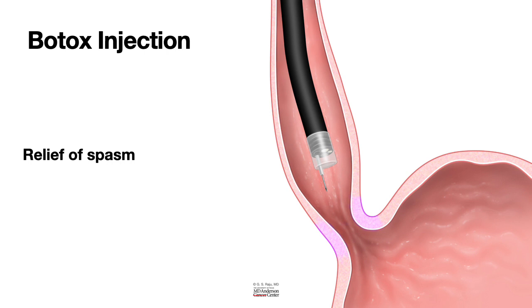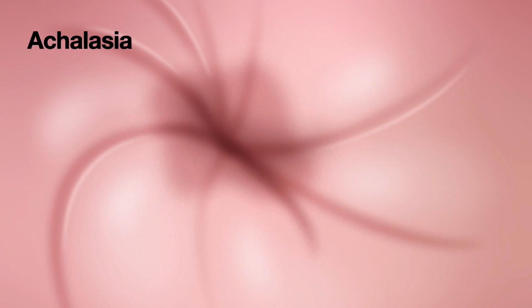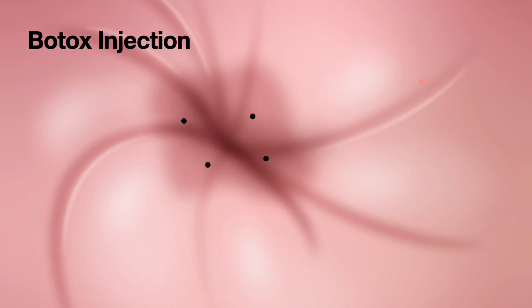Looking at this from the endoscopic view, you can see a tight lower esophageal sphincter that is hard to pass through. We start injecting Botox into four quadrants of the lower esophageal sphincter. Some endoscopists use eight injections — four quadrants very low and four a little higher — injecting 10 to 15 units per injection site. I typically use four injections of 20 units each. By the time the injection is complete, the muscle relaxes and you can pass the scope through easily.